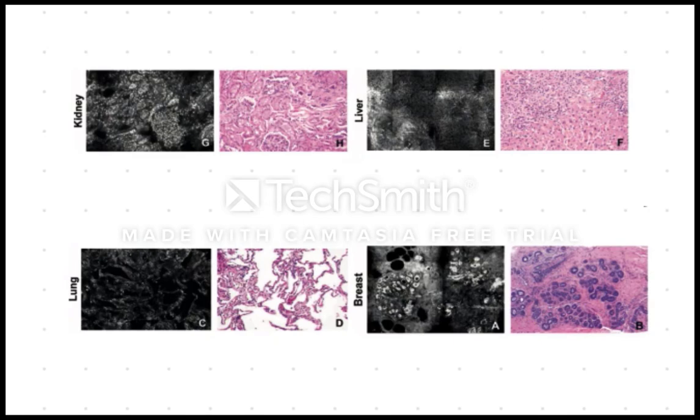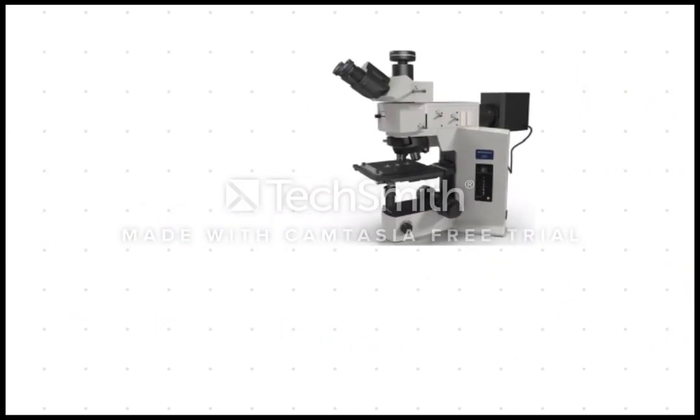The CFM images clearly showed the utility of non-invasive imaging, its ability to reproduce recognizable architectural features in the samples, and its feasibility for rapid examination, as well as having advantages over frozen section analysis, which is a common practice in surgical pathology, as freezing tissues for later examination can take up to 30 minutes to prepare, cause artifacts in the tissue, and has a lot of tissue loss compared to CFM.